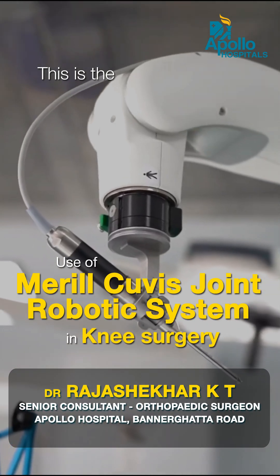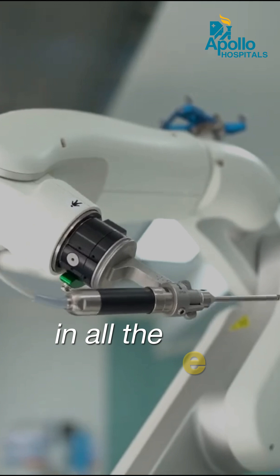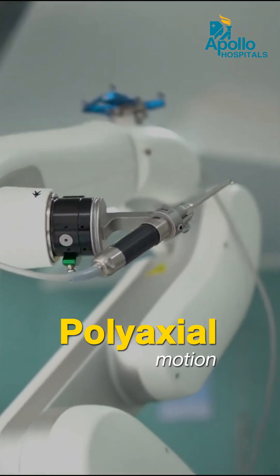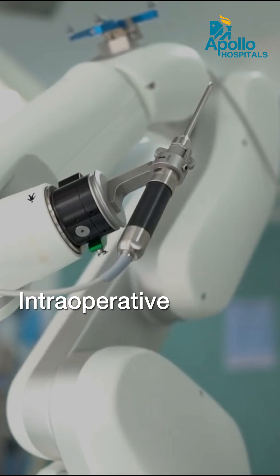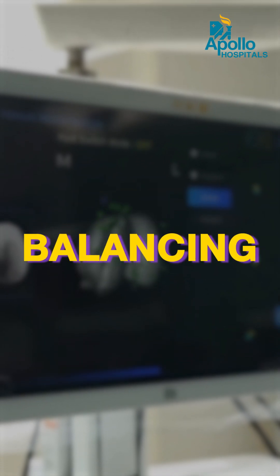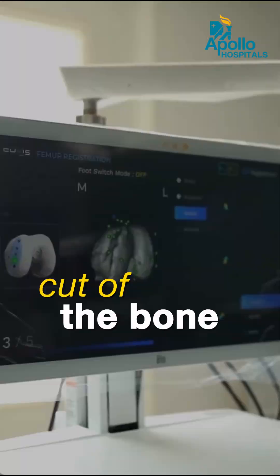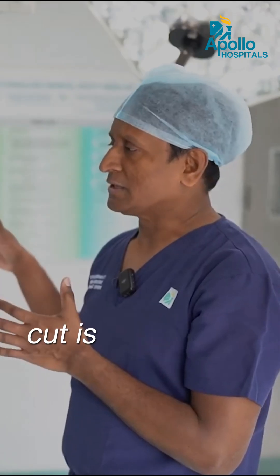This is Asia's first automatic robot — it cuts the bone on its own and moves in all angles with polyaxial motion. It is planned with the CT scan and intraoperative observation based on ligament tightening, alignment, and balance, so that the exact cut of the bone will be performed by this automatic vision robot.